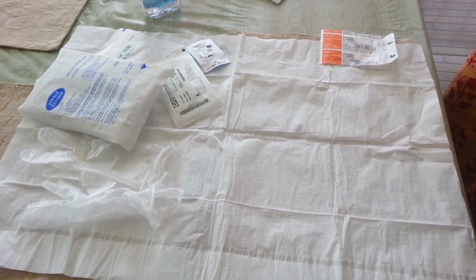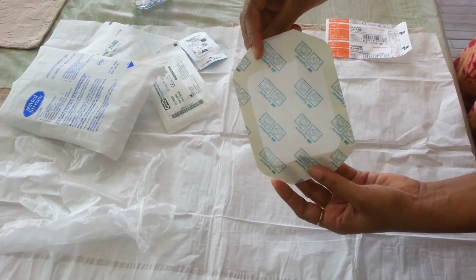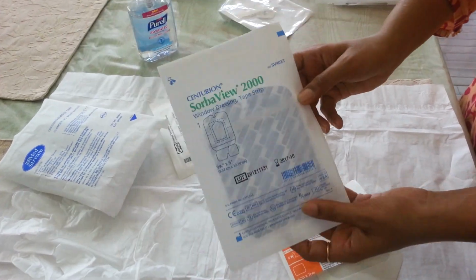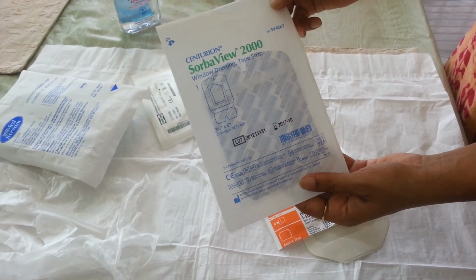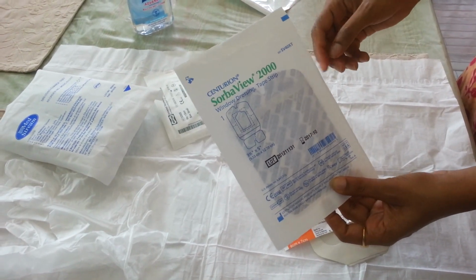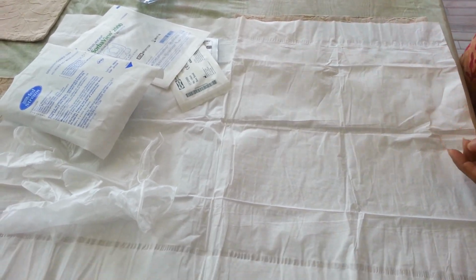Let's talk a little bit about dressings. There are various kinds of dressings available in many shapes and sizes, like Tegaderm, IV 3000, and SorbaView window dressing. This is the one I use. It's called SorbaView SV40XT. I like the fact that it is a window dressing, therefore I can keep an eye on my Picc line. It has a nice border with good absorption capacity that helps keep the site dry. It also comes with a SorbaView shield inside that can be used to secure the hub area. So now we will proceed with setting up the new dressing kit and removing the old dressing.